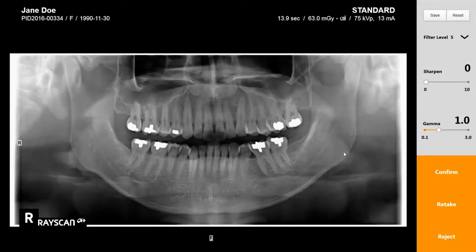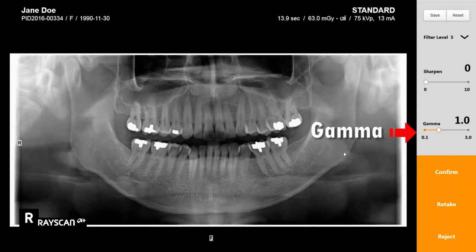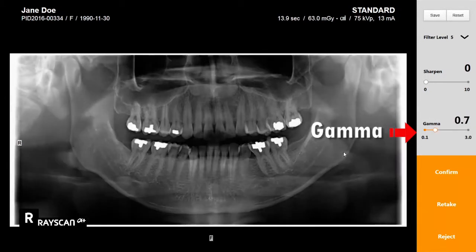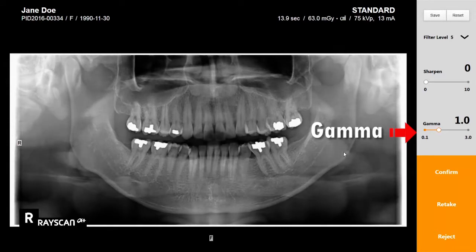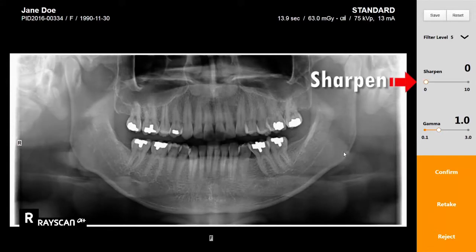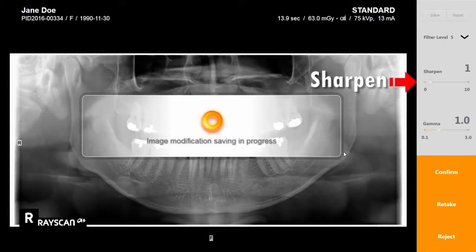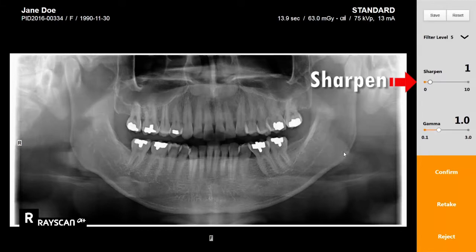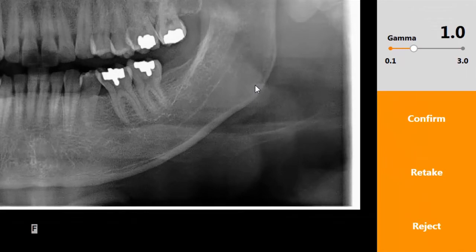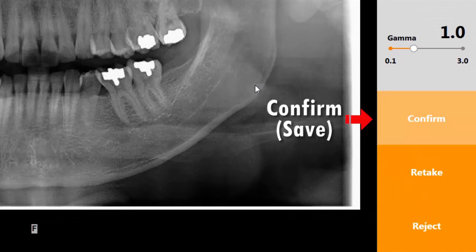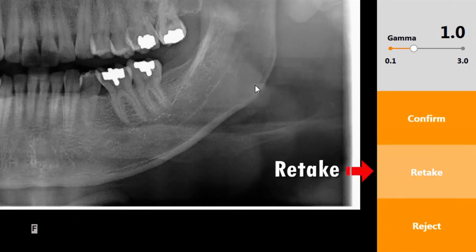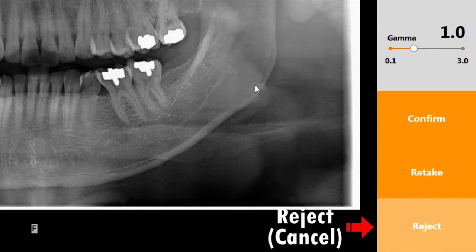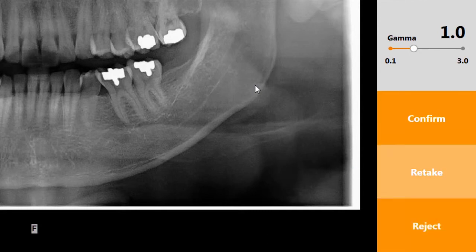After the image acquisition, make any desired optimal image adjustments by adjusting the sharpen or gamma value. Click the confirm button to save the image.